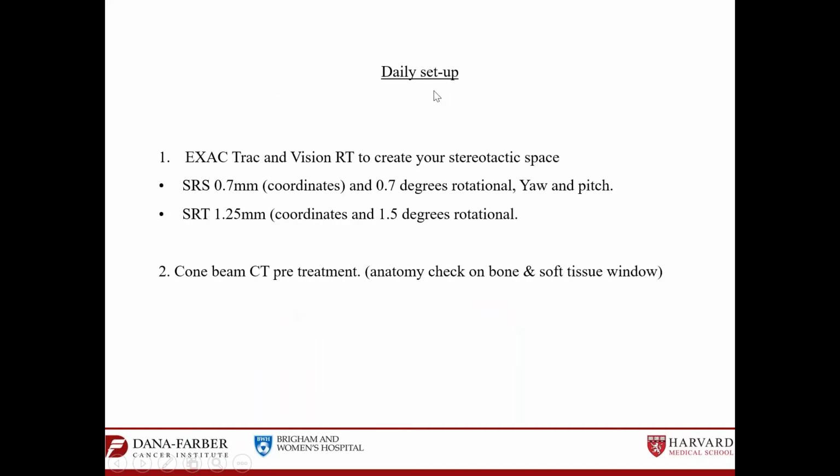Now for the daily setup, when the patient is ready to have the treatment today, you will check the immobilization before the beam on with ExacTrac and cone beam CT. I would say the cone beam CT has no cut points for deviation. If you see a 3 millimeter deviation, don't accept the image and try to repeat it, try to adjust the patient. It's just like how you check the fusion when you fuse the MRI with the CT planning; it's the same for the cone beam CT.